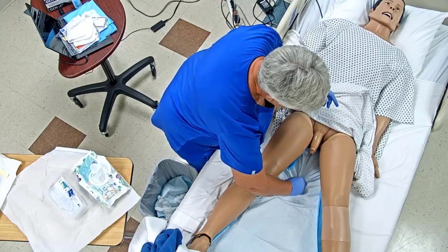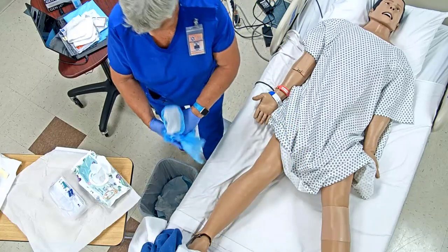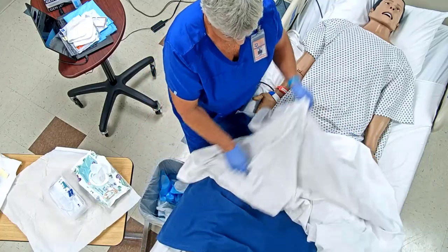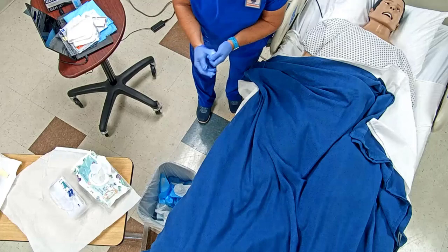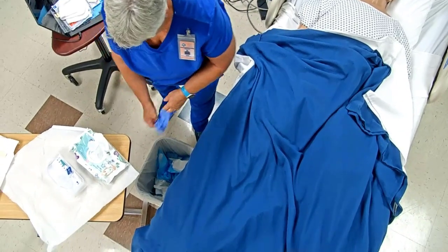We want to get this out from underneath our patient. It's clean, so I'm going to go ahead and get my patient covered up. Okay, I'm going to go ahead and gloves, skin to skin.